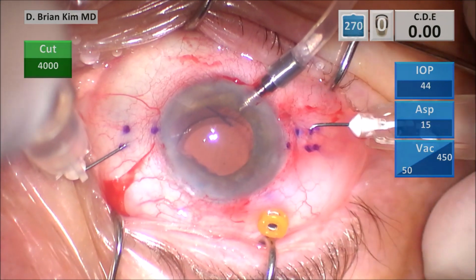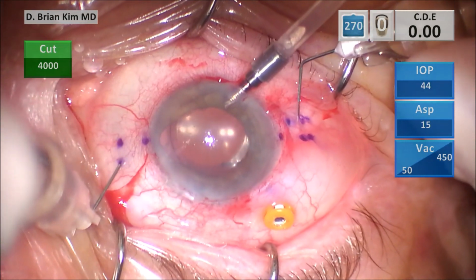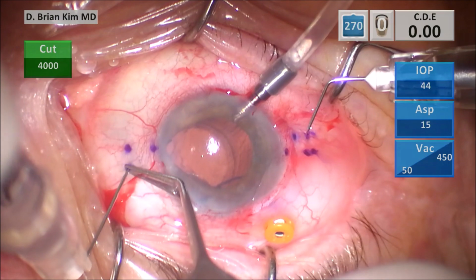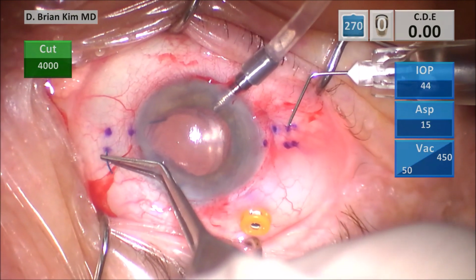Once I do this, I turn the needles in the direction that it was pushed through the sclera. The left one goes down, the right one goes up. And once I have it in this position, I externalize, grab with the microforceps before it comes out too much.